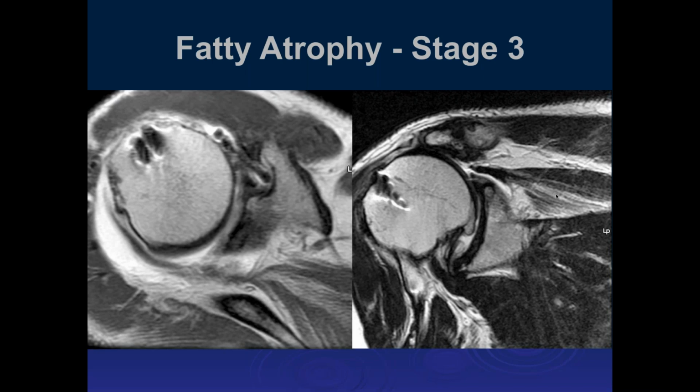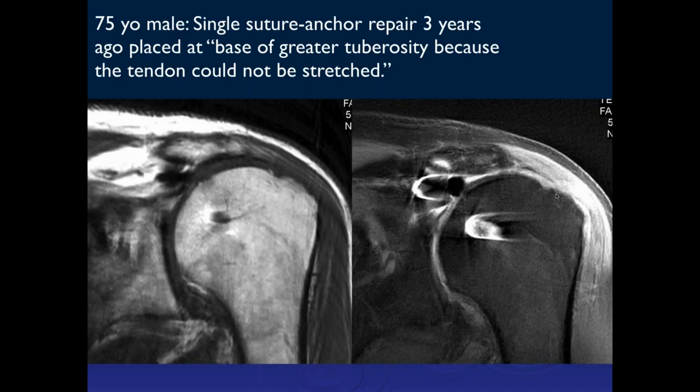It becomes stiff. Yeah. Okay, what do you think here?